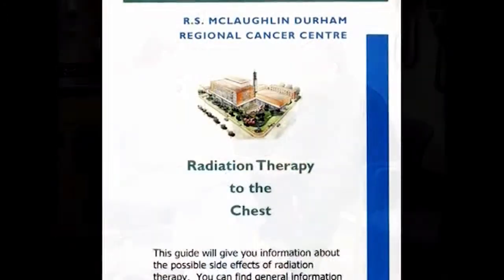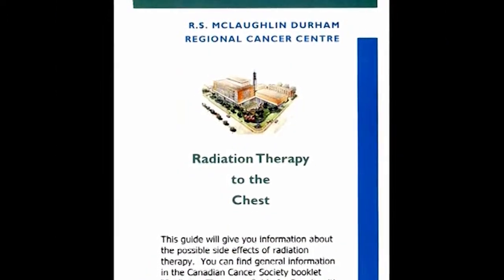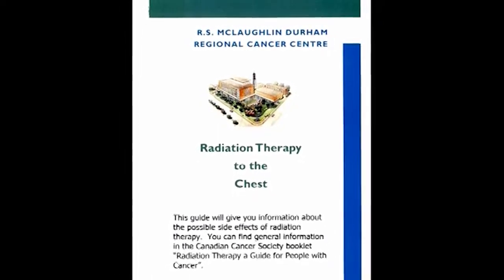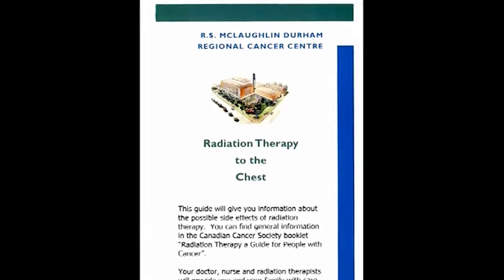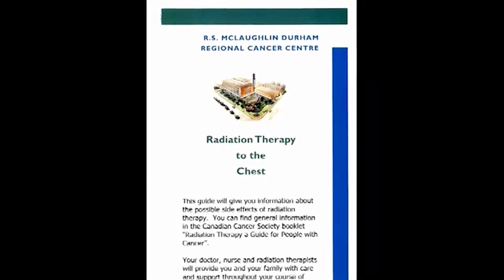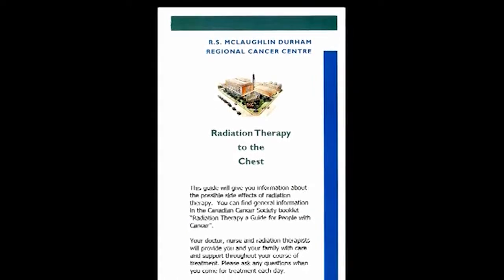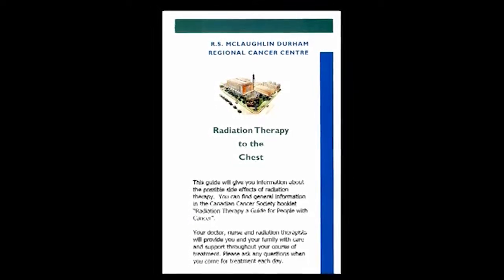The information pamphlet will also explain what to expect on the first day of treatment and any special preparation you may need to do. Please read the pamphlet before your first treatment session. If you have any questions, ask your radiation therapist at this appointment.